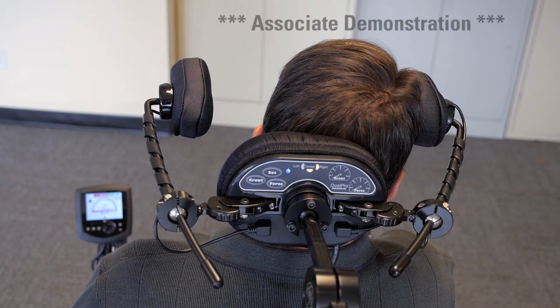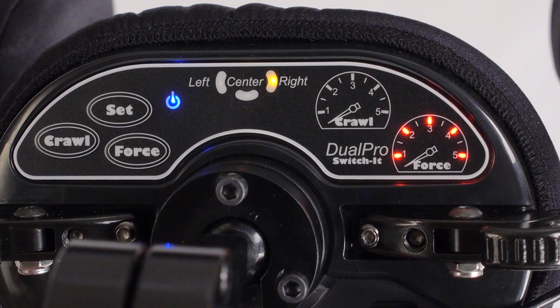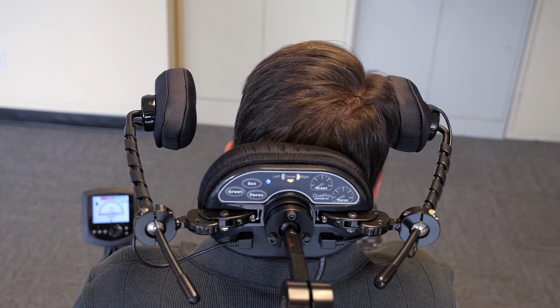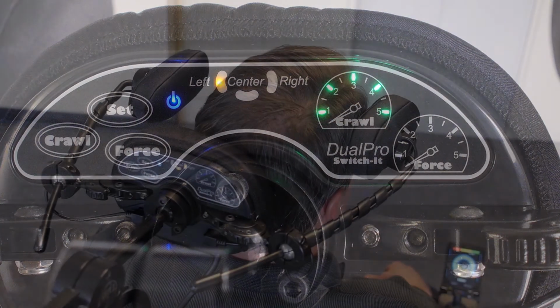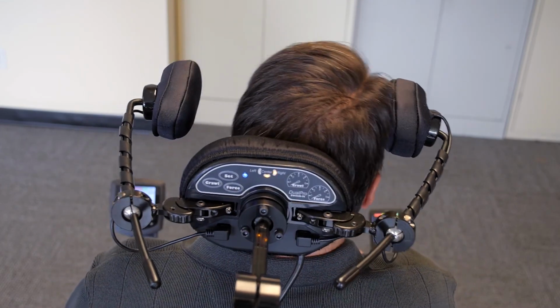A more complex example might be an individual who rests their head on the right pad and has difficulty moving it over to the left pad. In this case, the right pad could be set to 5 lights, or maximum force with no proximity or crawl. This would allow the individual to lightly rest their head against the right pad without moving the chair. If they press harder into the pad, the chair will turn right. The left pad could be set to proximity only, so the individual would only have to tilt their head to the left to initiate a turn.